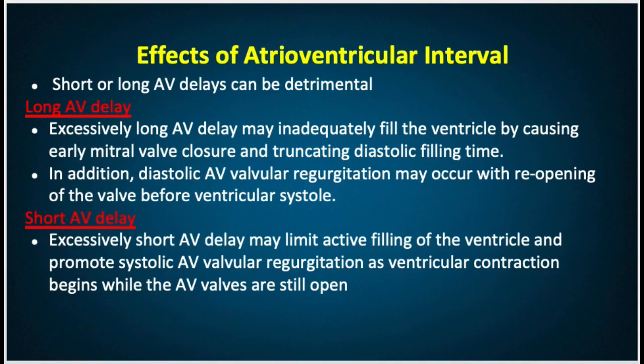Usually, Doppler echocardiography is used to optimize the AV interval by assessing the pattern of early and late diastolic mitral valve flow and the aortic flow velocity integral. When the AV interval can be optimized at rest, assessing the adequacy of this parameter in upright position and during exercise presents greater technical difficulties.